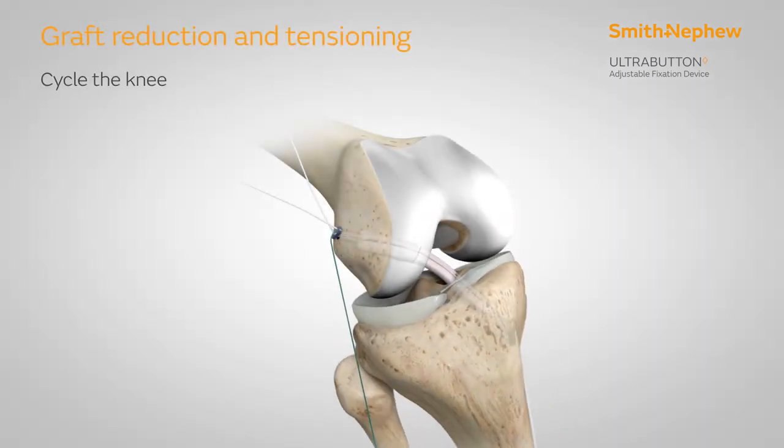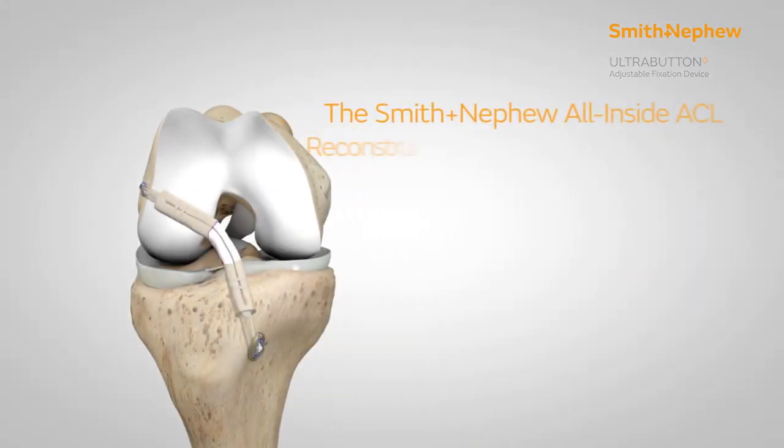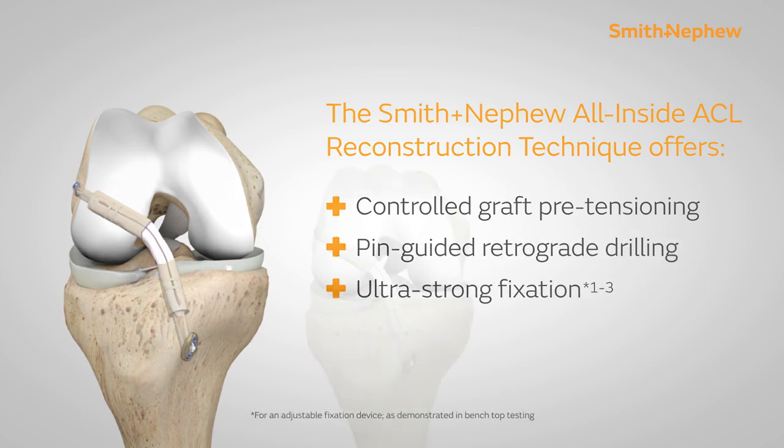Cycle the knee. With the knee in full extension, assess ACL tension and fine-tune as needed with either ultra button. The Smith & Nephew All-Inside ACL reconstruction technique offers controlled graft pre-tensioning, pin-guided retrograde drilling, and ultra-strong fixation.